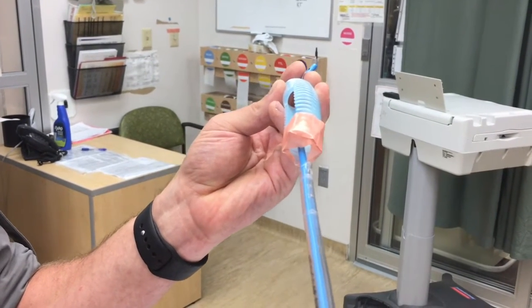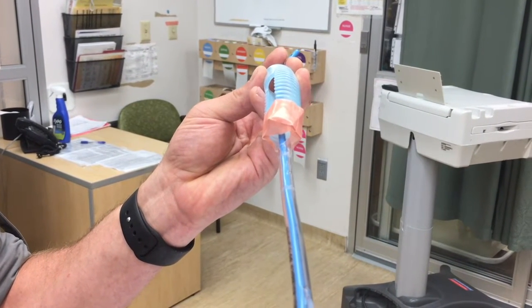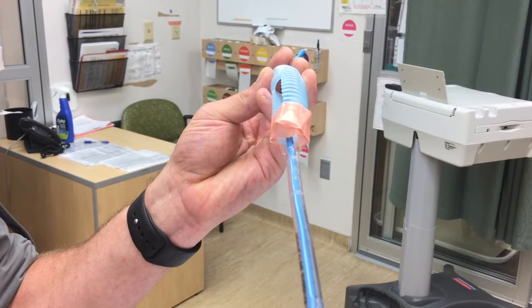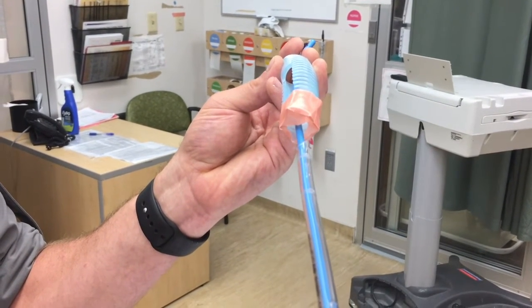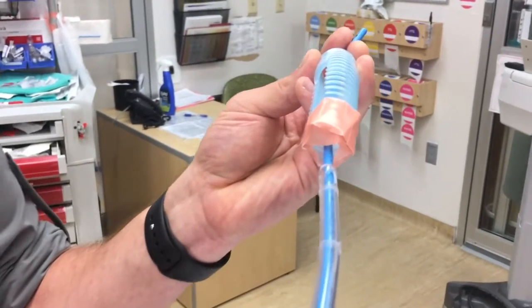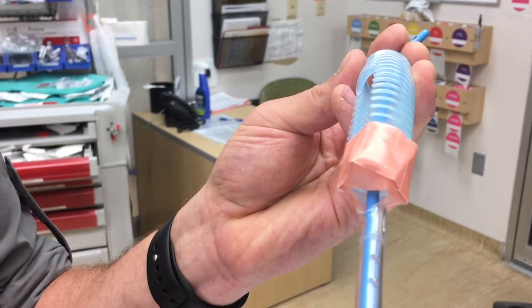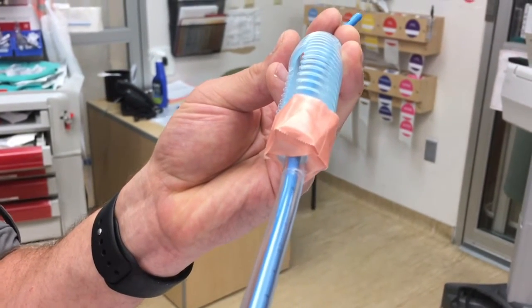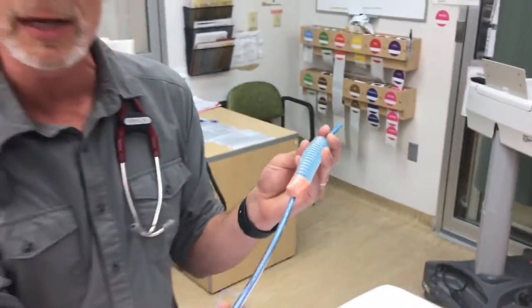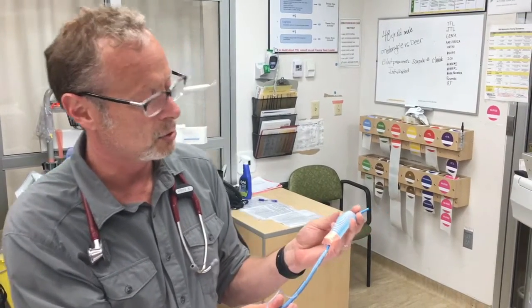So if you're using a bougie or doing a flexible scope and you meet hold up proximal to the glottic inlet, move to the left. Sometimes you have to bring it back and then move to the left and go down, because if it's hung up and you try to rotate it off, it's not going to move. So you come back, move left, and you'll sail in. Proximal to glottic inlet — you move to the left.